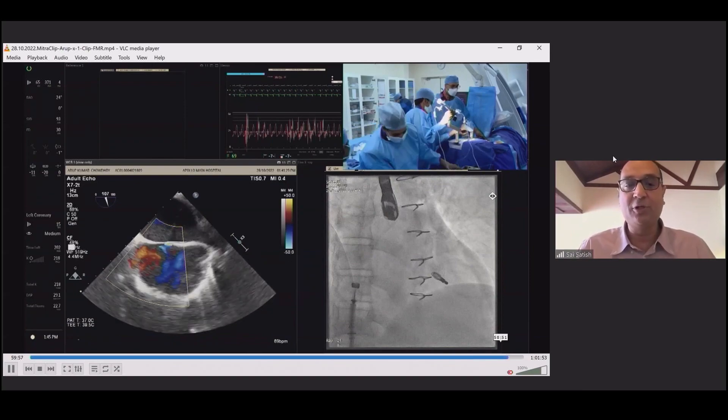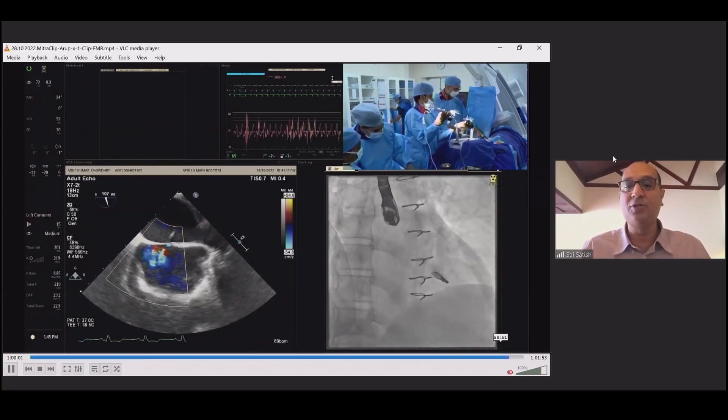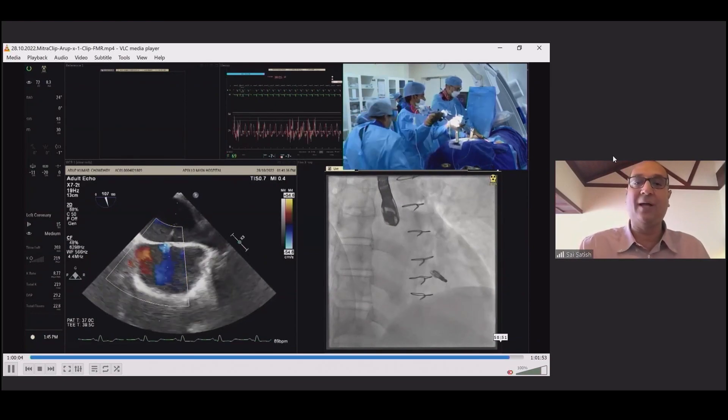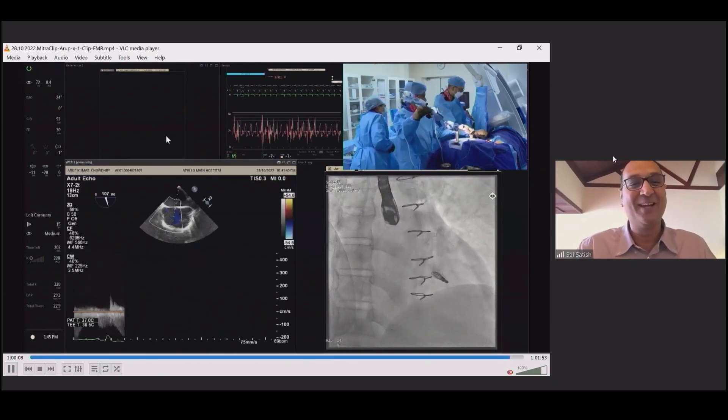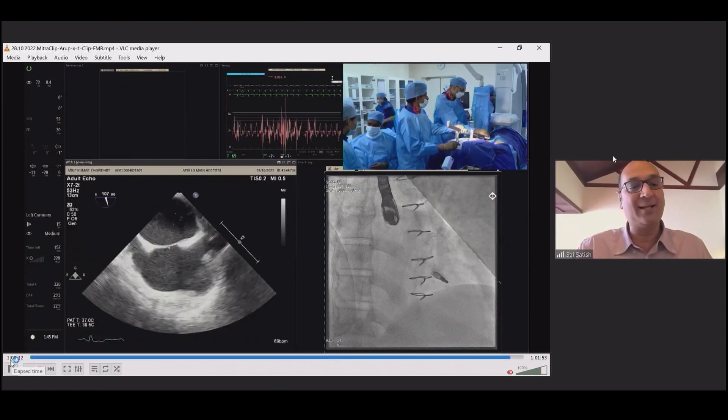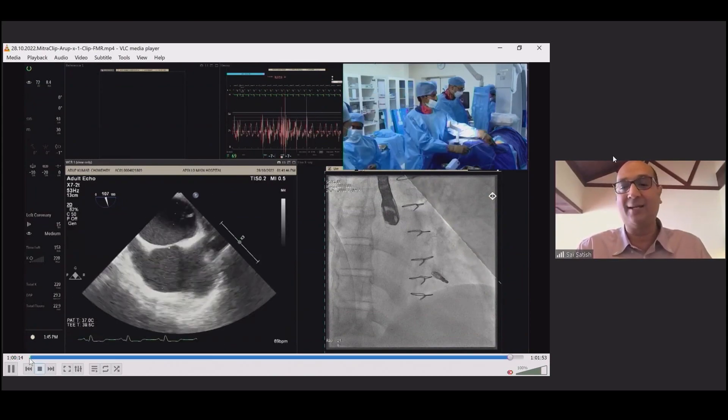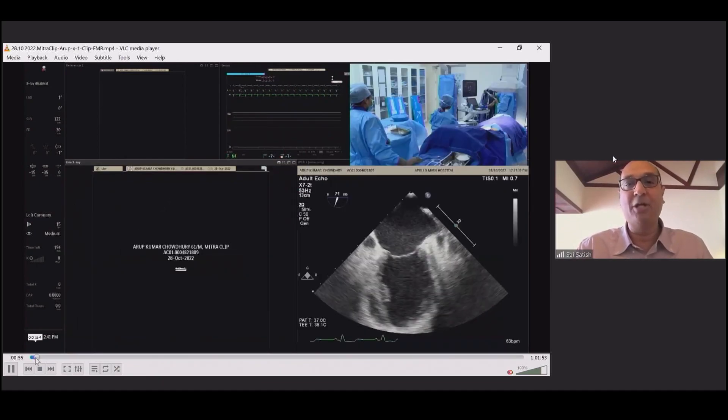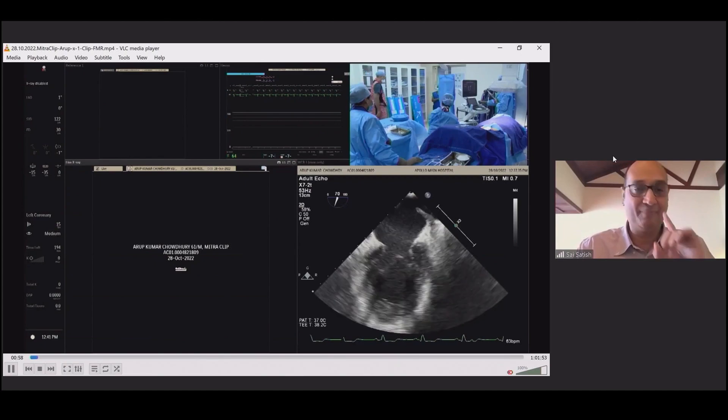What's really good is to see the clip move with the shadow of the heart. What I want to show all of you before I say goodbye is that this procedure was unedited — you can see even in a complex case like this, from before I wash up, we started in one hour one minute and the procedure is done. The patient was extubated on the table and discharged the very next day. Thank you all. A big round of applause — not only for the lucidity of the presentation but your usual eloquence. A very difficult procedure has been made so simple. Thank you all, and we are now moving on to the live case. Bye Satish, bye bye.